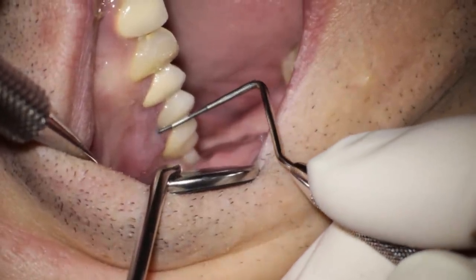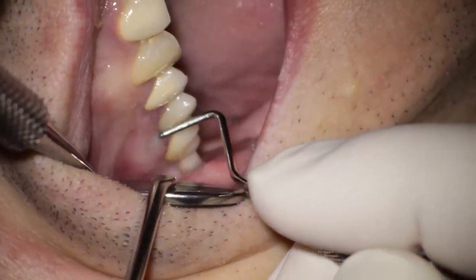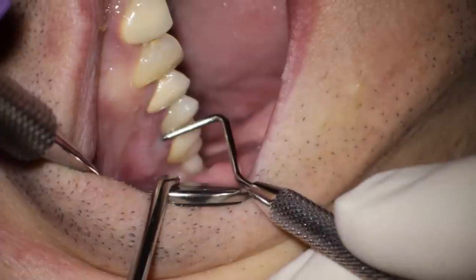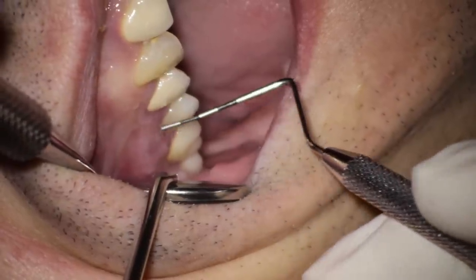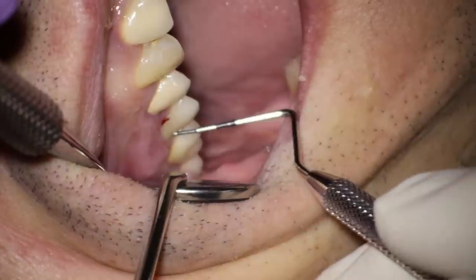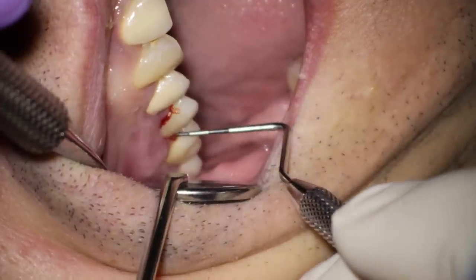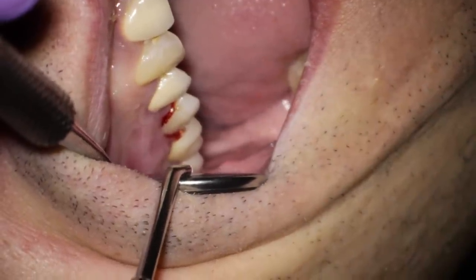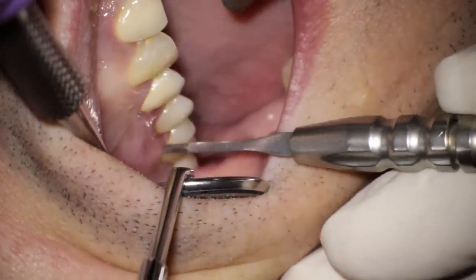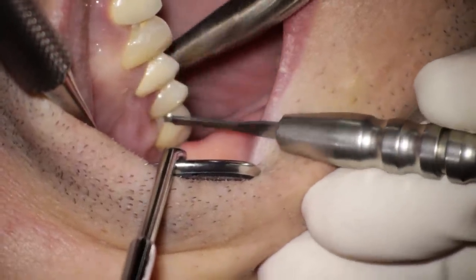Here you can see another upper premolar where the dental probe goes into the pocket very deeply — about 12 mm. Mesially and distally there are normal findings. This is most likely a fracture or could be of endodontic origin.